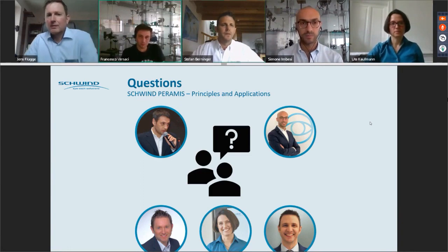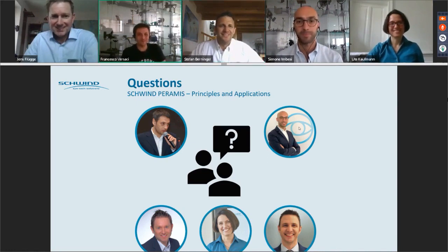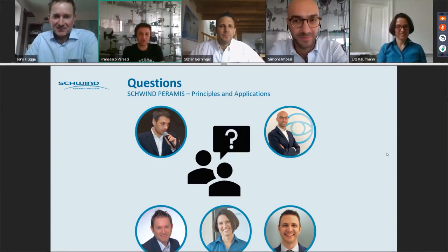Okay, fine. And the next question was, what machine uses a pyramidal sensor in the market? Osiris, which is the same as Peramis. As far as I know, the only device that uses this kind of approach is the one that we provide for CSO, so Osiris, or the one that we provide for SCHWIND, Peramis, that are actually the same device.